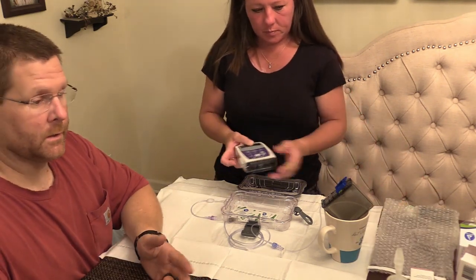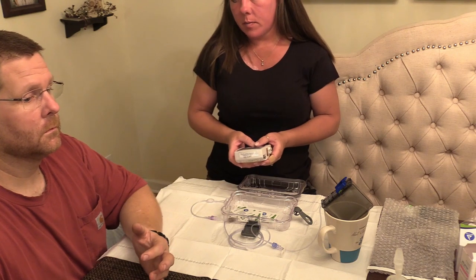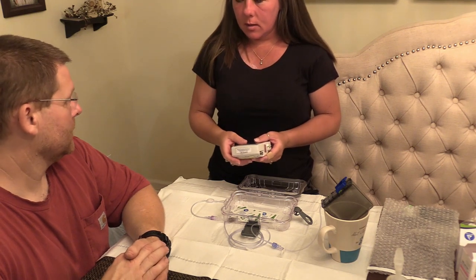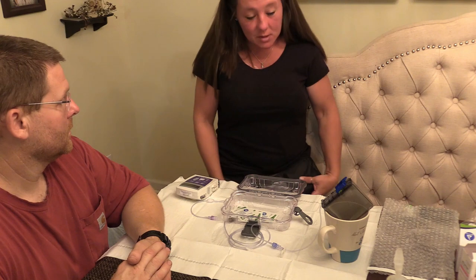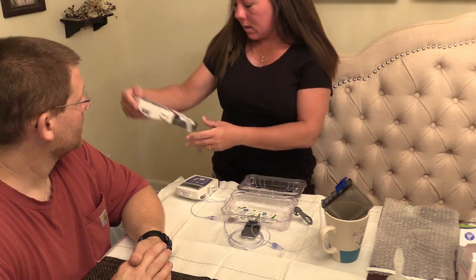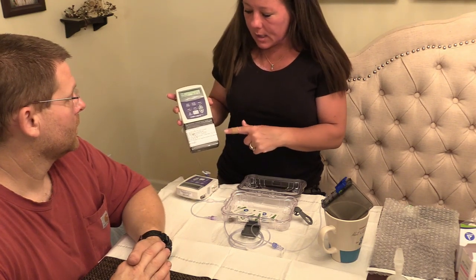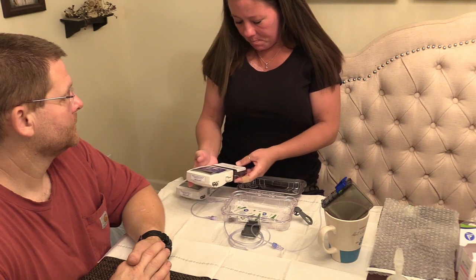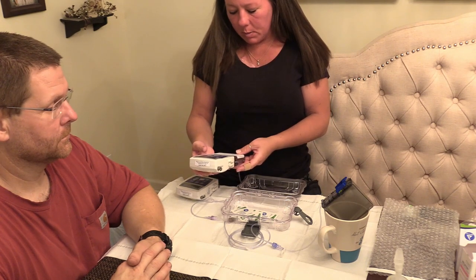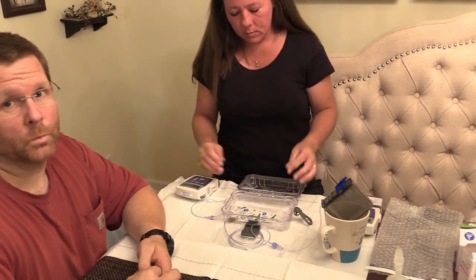Everybody's rate and doses are going to be different. So what are you on right now? 83 is the rate. We didn't put a label on that one yet — we do have labels just in case anything ever happens, so hospitals know exactly what's in here and how much. So I'm on 83 milliliters per 24 hours and 23 nanograms per minute.